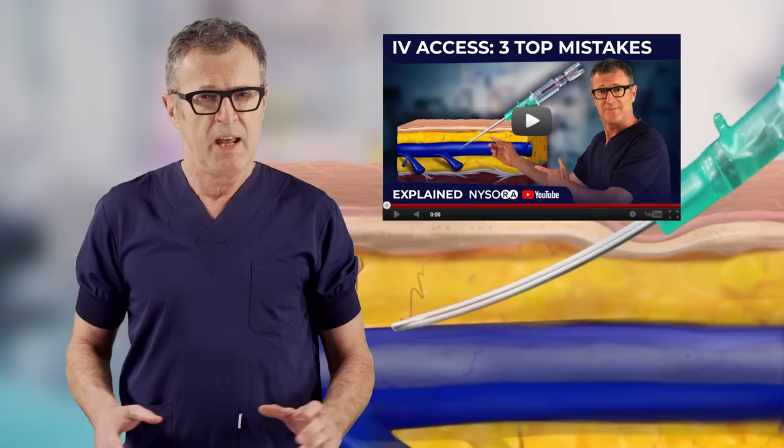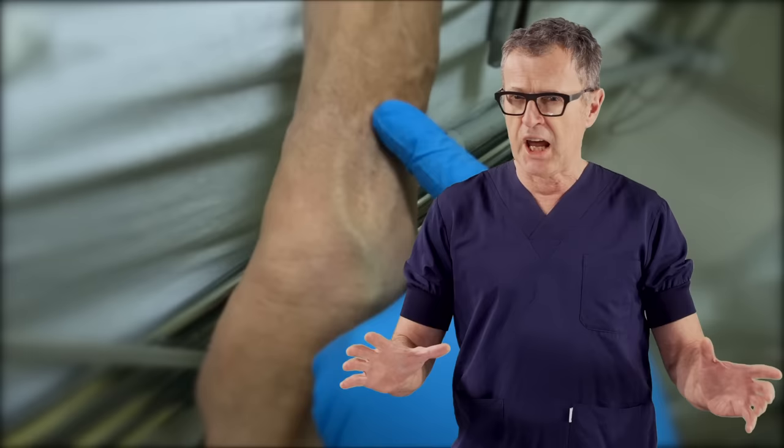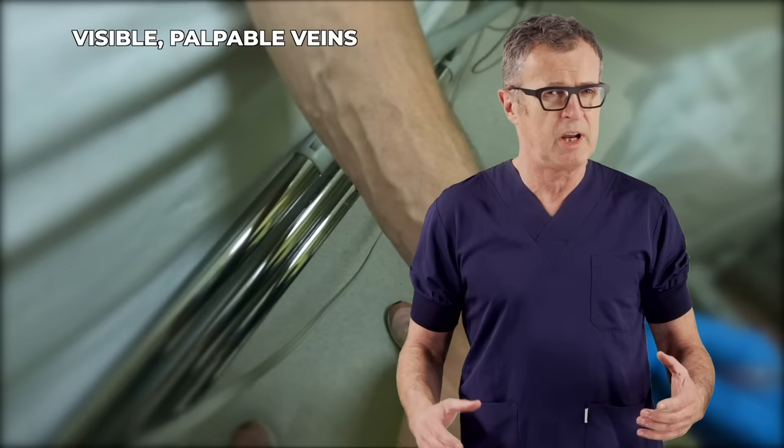At the end of the video, we will explain strategies on how to avoid failure at an attempt to IV access in patients with veins like this. Here's an example of the seemingly easy veins. The application of the tourniquet in this patient quickly brought about a number of veins that are visible and palpable, so it looks like a no-brainer.